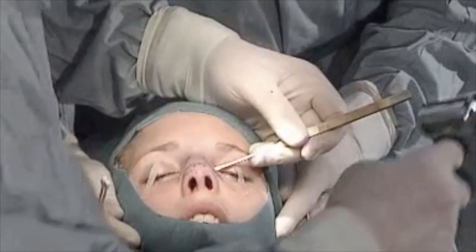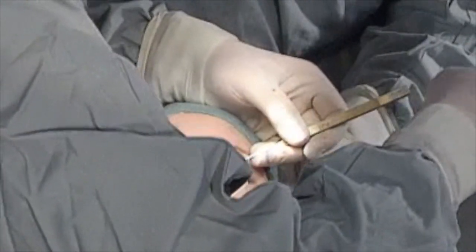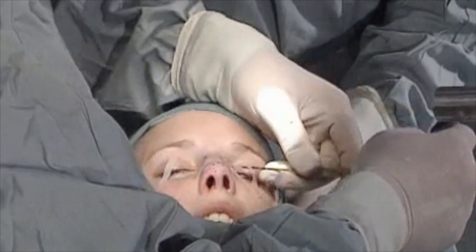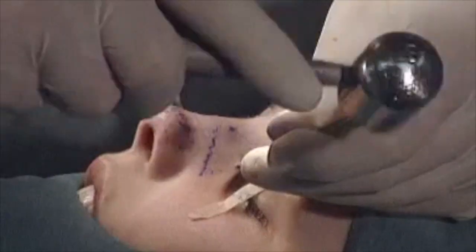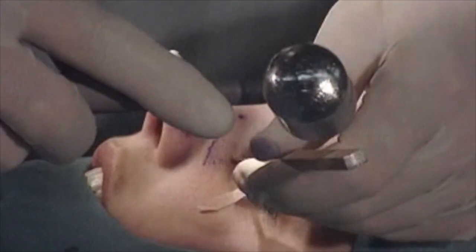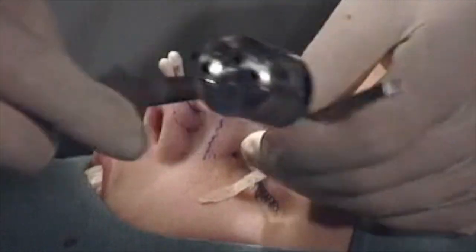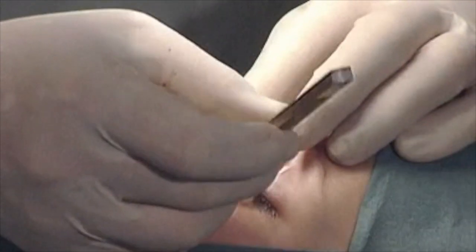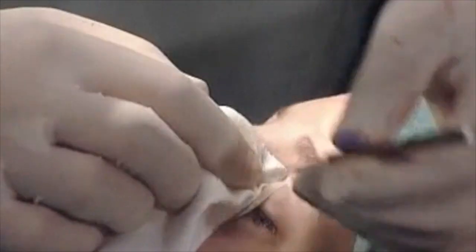Okay. Very strong bone. Okay. Then we check if that's enough. Try to do some infraction.